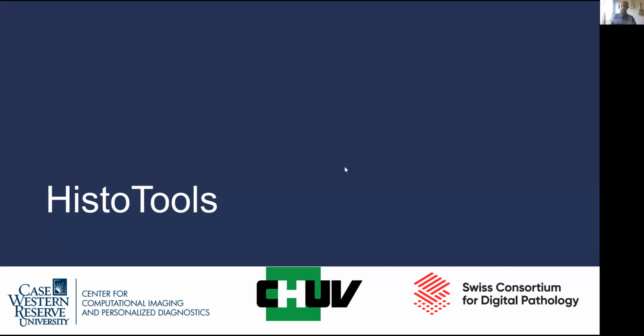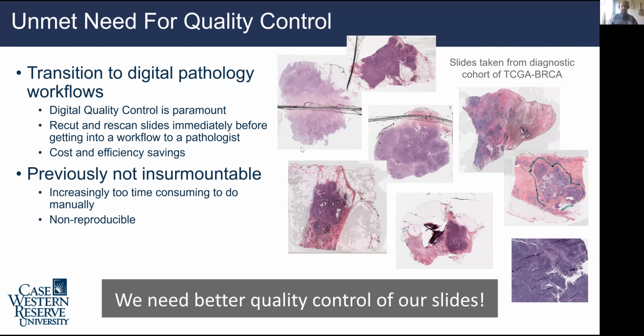Thanks. So I think most of the folks in SDiPath are probably familiar with these tools, but I'll briefly run through them to conclude this meeting. So we built 3 tools. The first tool is for quality control.